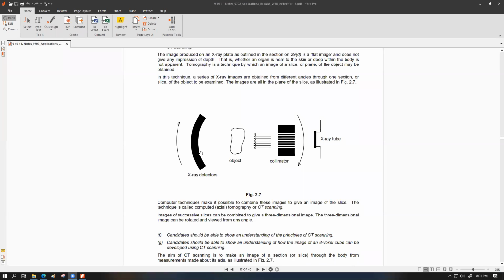So these X-ray detectors are capable of getting a person's inside information in terms of how much radiation could pass through a certain location. Now, what do I mean by this? Whenever I say a certain location, what does this essentially entail? An important bit that you really need to understand is that for the case of a 2-dimensional image, we use the term pixel. The term pixel is essentially applicable for a 2-dimensional case.